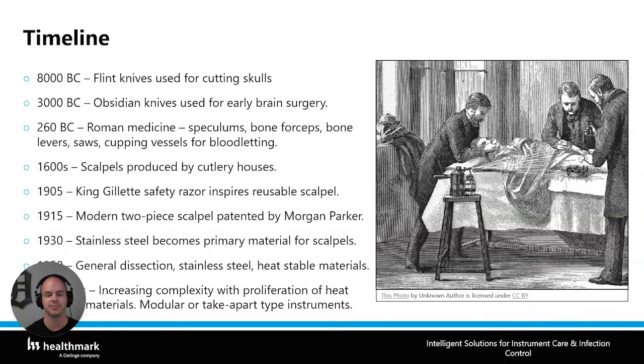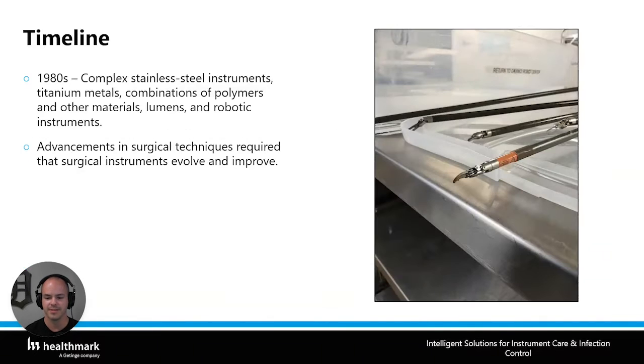One of the things that was unique about him was the development of germ theory, which led to the development of asepsis, which then led to us, here in the 80s, 90s, and 2000s, being able to focus our advancements on the instruments, making them more complex with lumens and combinations of polymers.